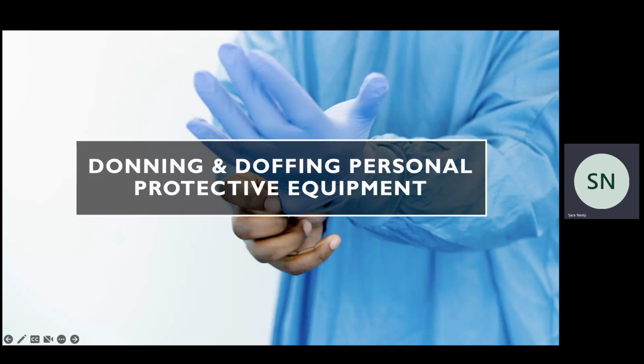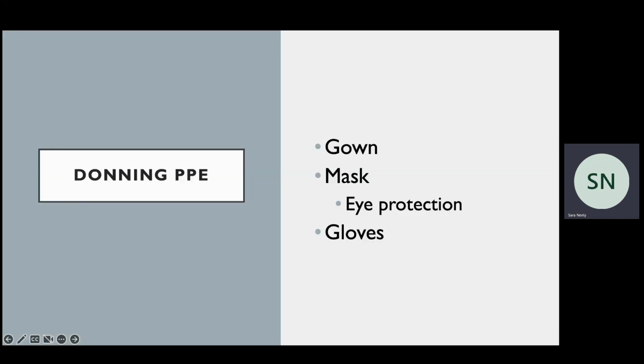And now we're going to talk about donning and doffing PPE. As I said before, donning means to put on, and doff means to take off. As silly as it may sound, there is actually a correct sequence for putting on and removing PPE, and all employees at Rush, regardless of status, must do this correctly. When Rush is visited by the Joint Commission or CMS, they're going to be looking at your actions along with the doctors and the nurses and all the other clinical staff. So make sure that you know how to do this appropriately.